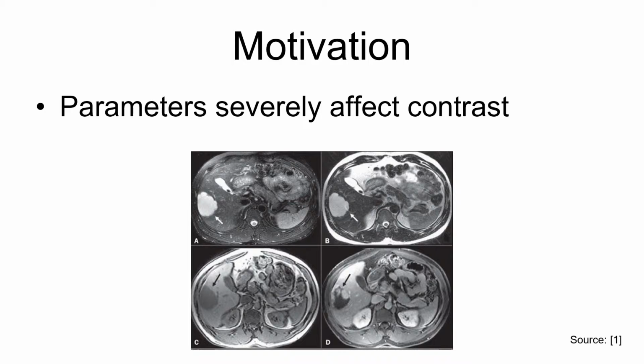It will be pathologically useful because those such as liver tumors have a larger T1 than normal tissues. Moreover, abdomen tissues are all close to each other. It will be useful if contrast between two neighboring tissues is maximized, so that one tissue can be distinguishable from others. If there is a way to maximize contrast between abdomen tissues, it will be better for doctors to do examination. With the help of MATLAB, it can simulate different kinds of sequences and calculate steady-state magnetization. We can numerically simulate the process and reconstruct the image.